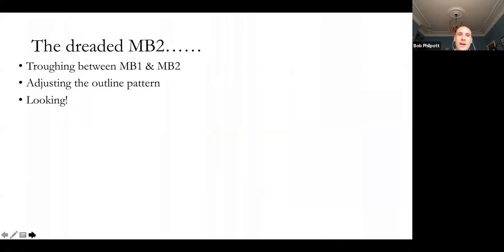And I've talked about adjusting this outline pattern. Do that, okay? So that if you're accessing and you think, if I could just extend it a little bit, you're making the decisions here. No one's watching over your shoulder. If you think that's appropriate and that will help you, it's better you look for your MB2. You might not find it, but it's better that you look than if you don't look.